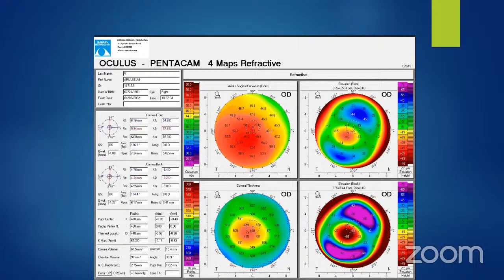So in any such patients, what you would do is to have a contact lens trial, scleral contact lens trial, and see how much the patient is improving. But don't give the contact lens yet: cross-link the patient, wait for at least 3 months, and then have a repeat contact lens fitting, and then give the lenses. Okay.